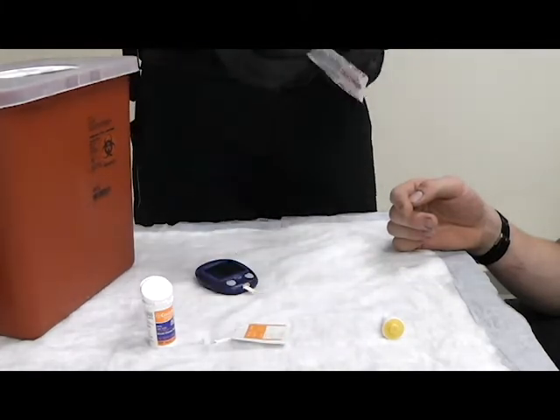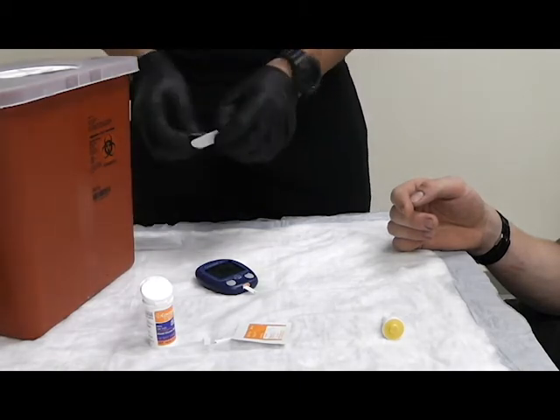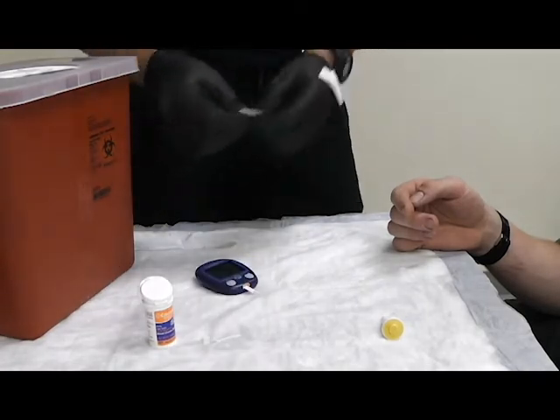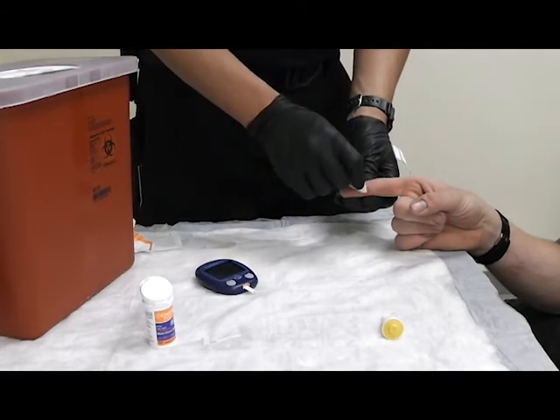I'm going to set that to the side. I'm going to prep my bandage. I am then going to take my prep swab and clean the finger in a bullseye pattern from inside to out.